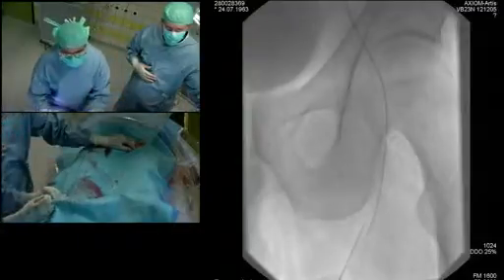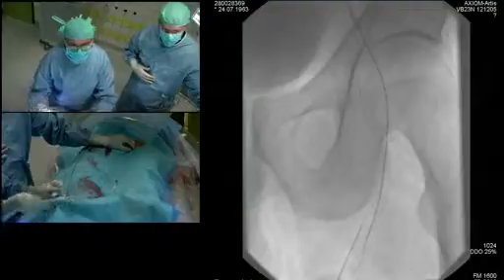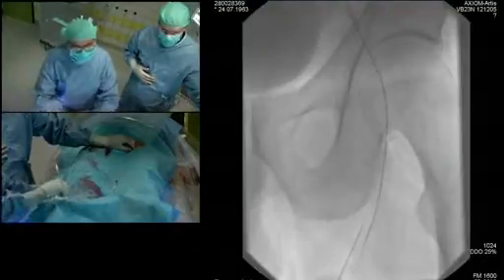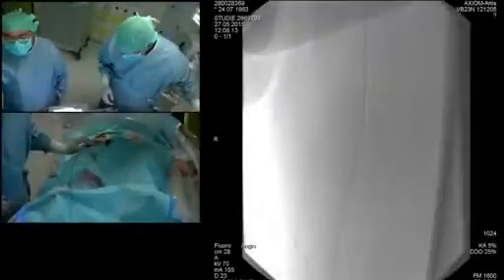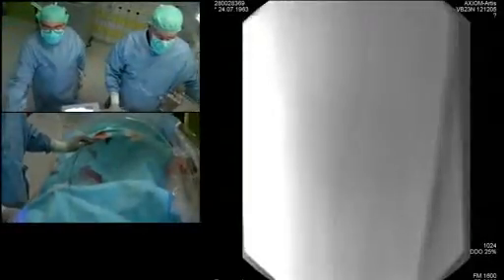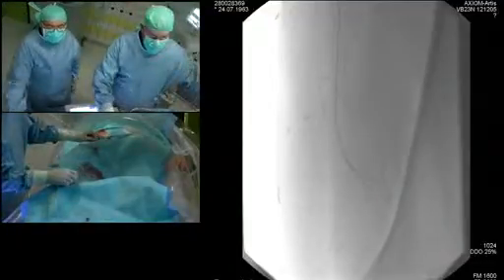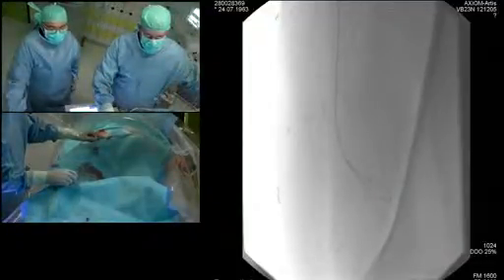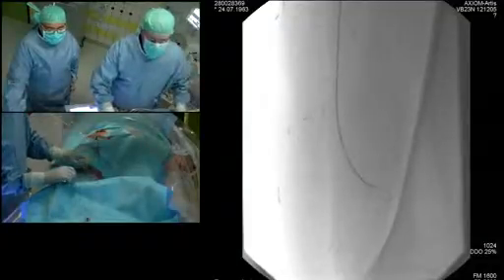Okay, I think you have entered already somewhat. Yes, this is the bypass. And it's very, very soft. So let's bring it down. So the distal anastomosis should be on P3. Yep. Okay.